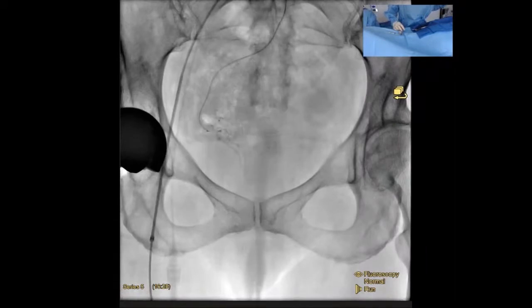Well, not even so much. If we can go distally, anastomosis, great. In this case, you can see there's just so many small channels to get past. But if we can, it might be nice to get beyond that first loop into the vertical segment of that artery. Right. So, we call that the corpus cavernosum rectum. Corpus cavernosum rectum. You're really calling out a challenge in this. That's a different cavernosum than what you and I are usually doing. Yes, exactly. That's a completely different cavernosum.